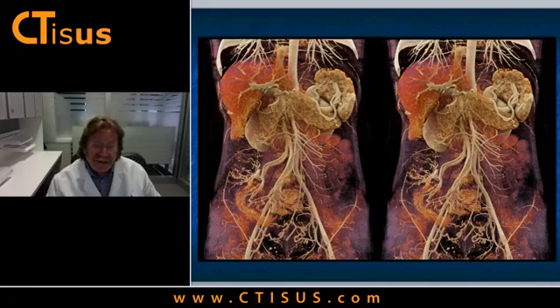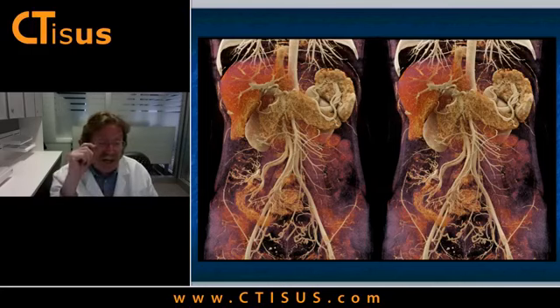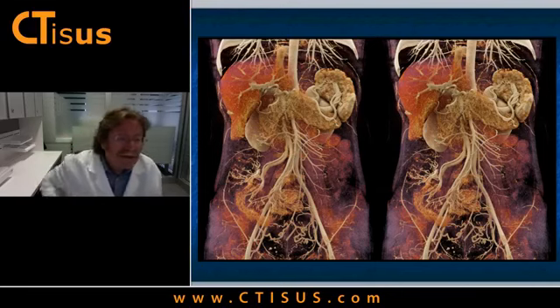I guess when people ask me the challenges, I think the first challenge is the data set. Without quality data, whether it's volume rendering, classic, cinematic, or MIP, you're not going to get good quality. So importance of injection rate, particularly when looking at soft tissues, importance of arterial versus venous phase imaging. If you're doing musculoskeletal, again, I find that using the soft tissue algorithm for bone makes better 3D images than using the high-res bone algorithm. With the cinematic, with the high-res bone, the images still tend to be noisy, or at least the soft tissues become very noisy, so it is more problematic to me. But that may just be our experience.